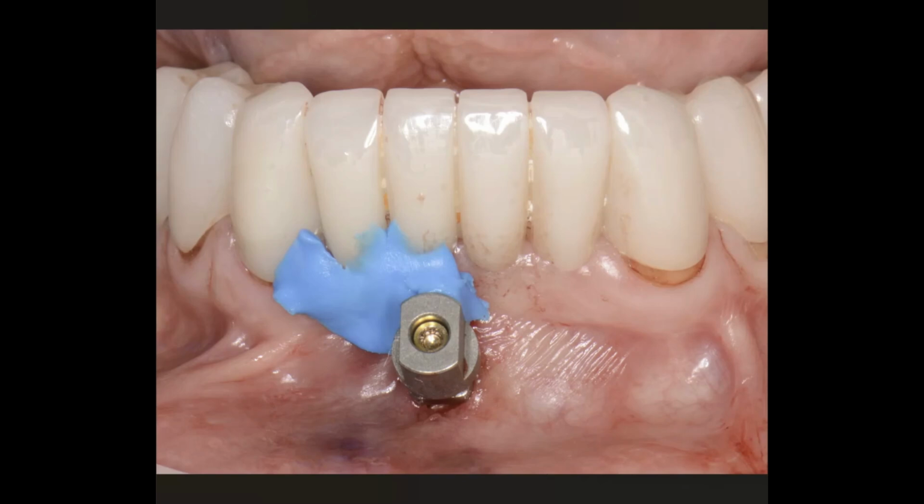And I'm going to show you some pictures and images here. By the way, this is a part of a bigger publication that my partners and I are publishing. I'll take credit for placing the fiducial in the midline. Some ideas I'm borrowing, for like the long bone screw, but I wanted to put this in the mandibular anterior. Dr. Keith Klaus, my partner in crime, for prosthetic workflow module 2, which is in September, he said this would be even better with an MUA on it, which is genius.